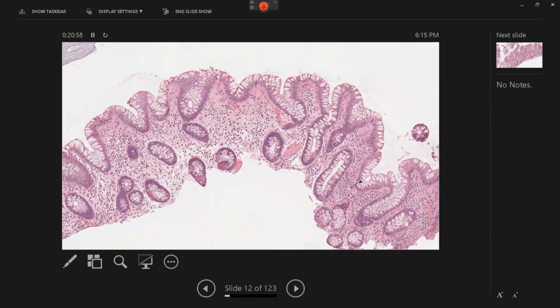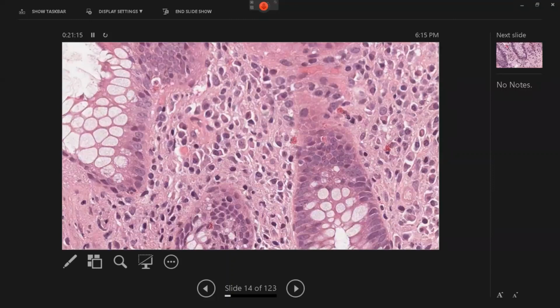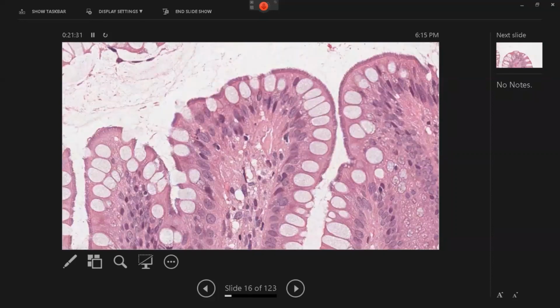The crypt looks fine, so we will keep looking into this. The surface looks slightly irregular, but the inflammatory cells look okay. And here I just want to show you the type of inflammatory cells toward the upper part and toward the lower part, you don't have clusters of plasma cells, hardly any plasma cells at the base of the crypt, to call it basal plasmocytosis. We discussed that.